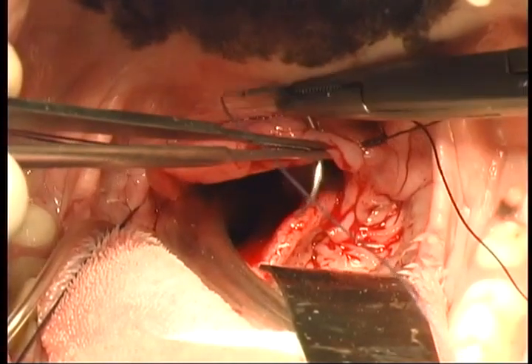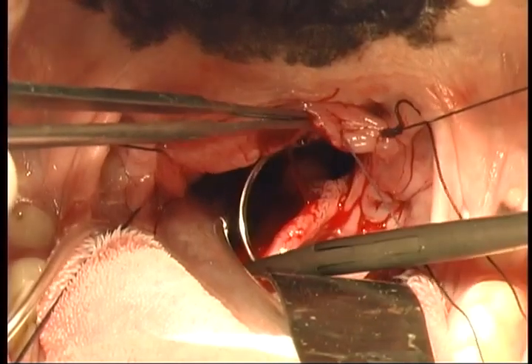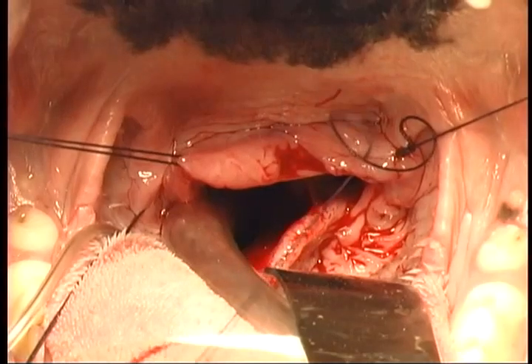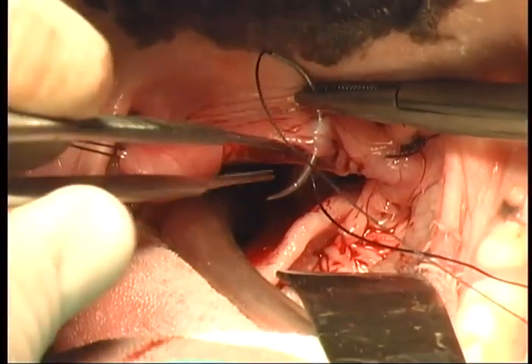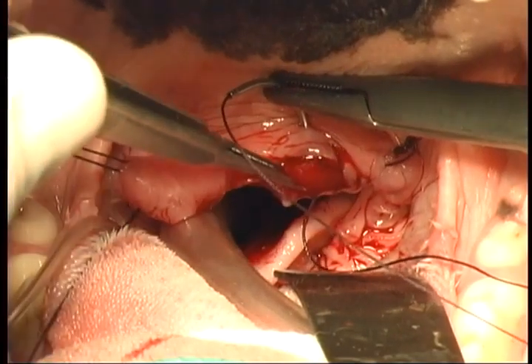You can see also that sutures utilized to act as stay sutures will, through traction and counter traction, encourage the surgeon to be able to manipulate the tissue when working deep into the oral cavity.